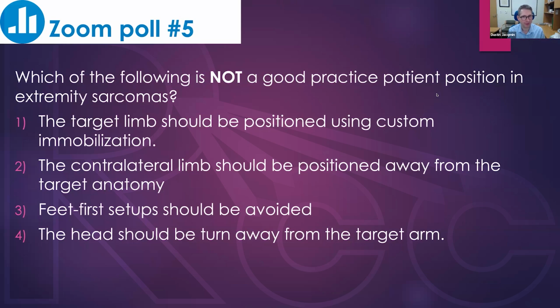The Astro clinical practice guideline discusses this in quite a bit of detail and actually has a table of, this is the dose the patient got previously. This is the recommended dose per fraction for the reirradiation case. And it goes through a bunch of different scenarios, from conventional radiotherapy to palliative radiotherapy. But yeah, spine SBRT is sometimes used in a reirradiation setting. And really what it comes down to is selecting the right prescription dose and the right dose limit to the spinal cord. And it can be done, it just has to be done safely. And so that Astro guideline is a really nice resource.